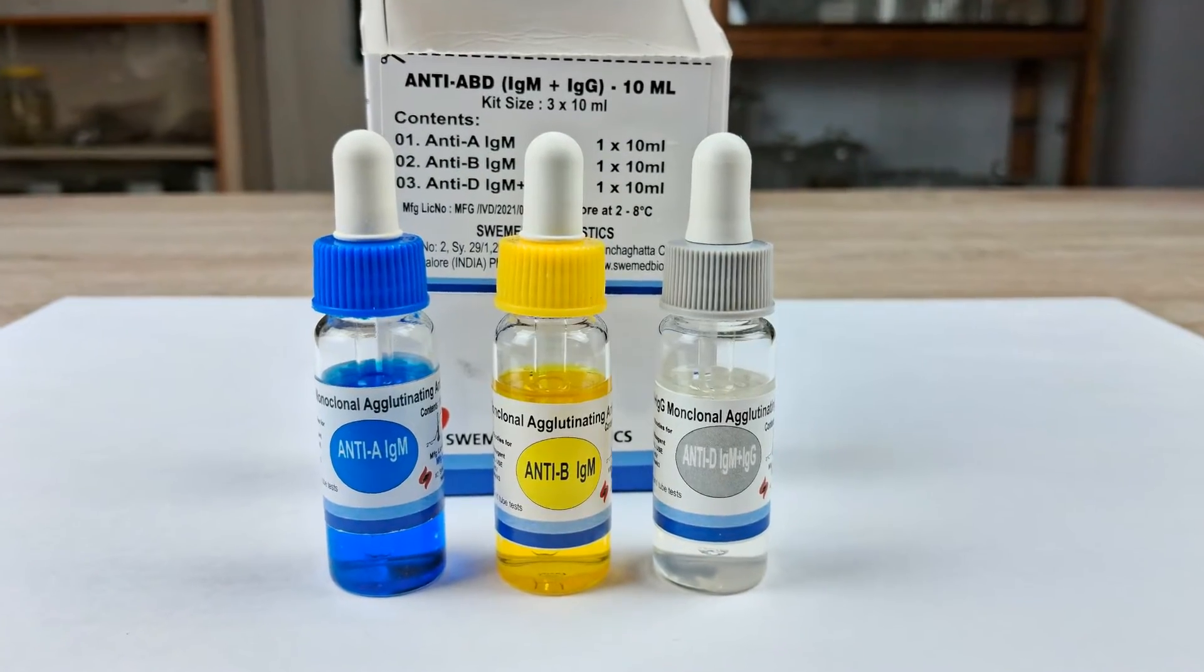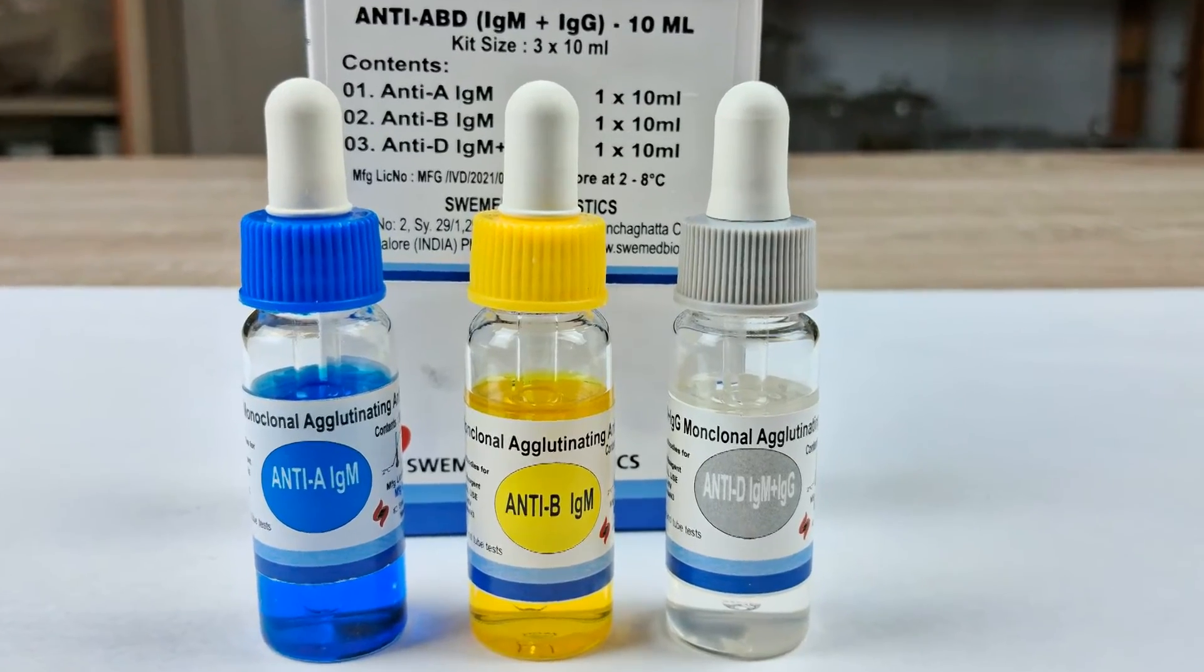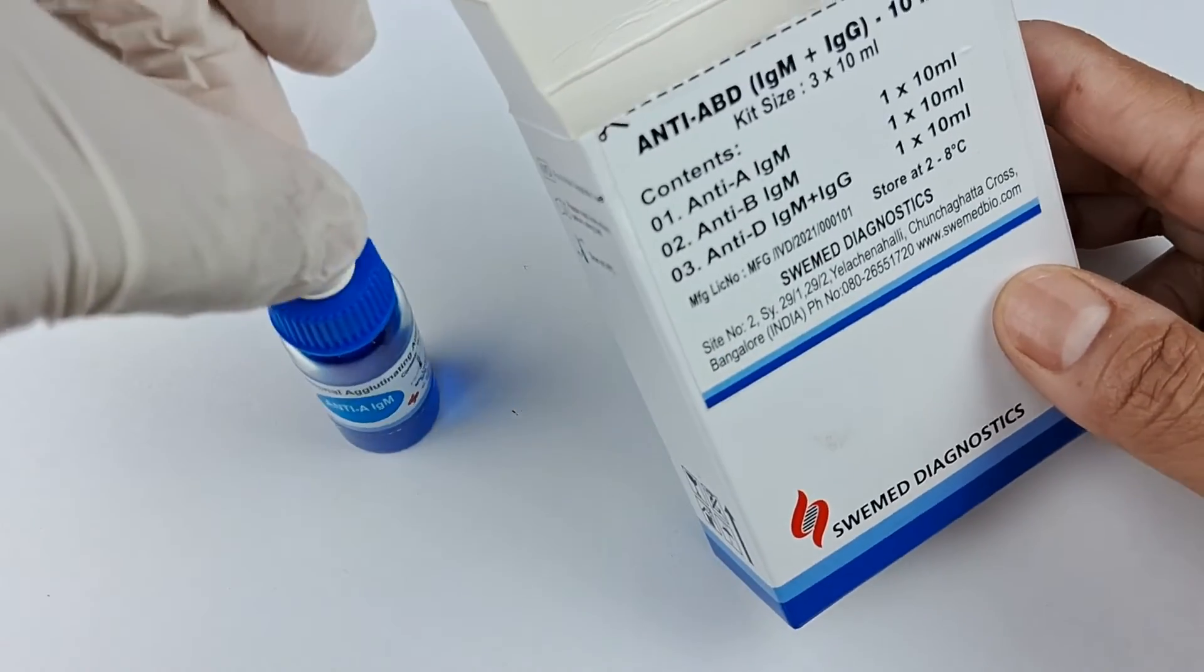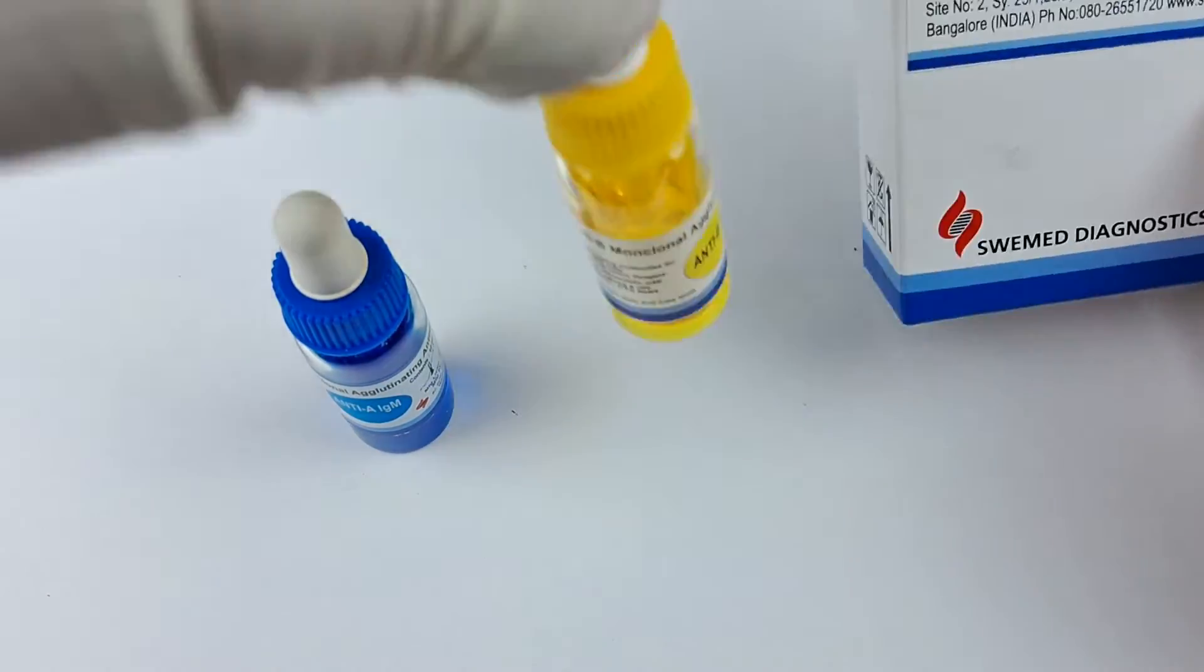ABO blood grouping test kit consisting of antisera A, B, and D antibody vials. To begin the test, first remove the ABO blood grouping test kit from the refrigerator.